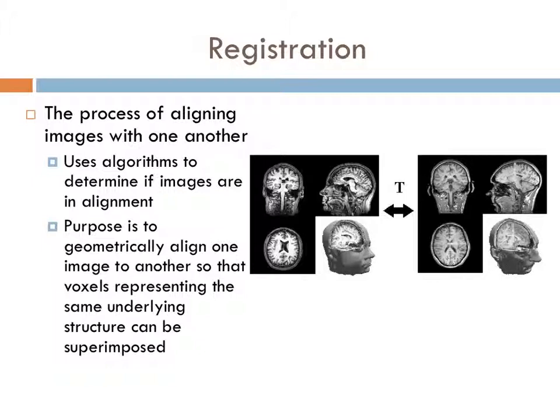It can deal with images from one modality, or it can deal with images from more than one modality.